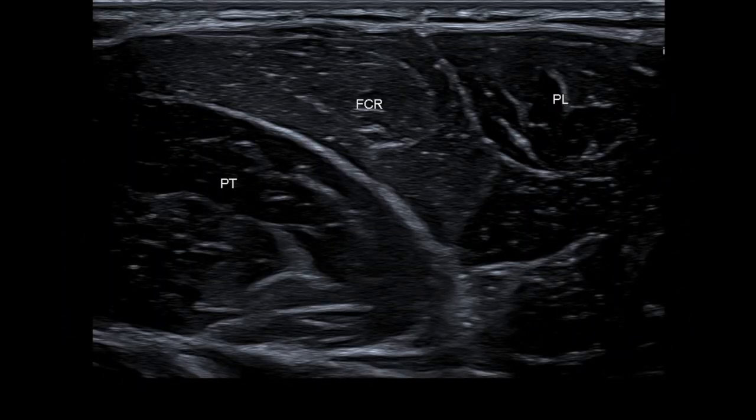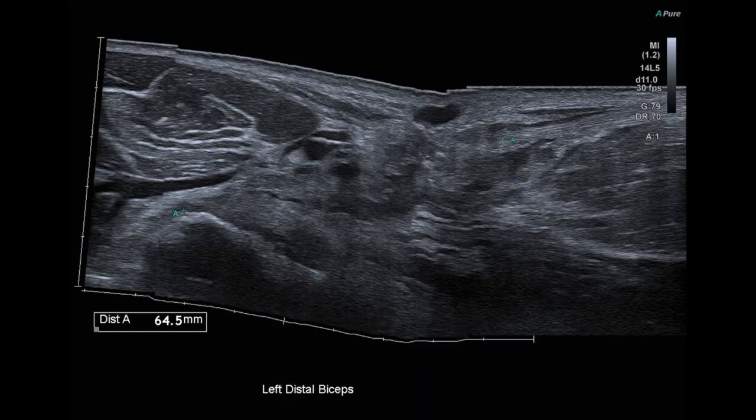Now, direct visualization is sometimes difficult, so the cheap way to do it is to scan the volar aspect of the forearm and look for any cobblestone pebble edema superficial to those flexors. If we see that, that suggests that the lacertus fibrosus is torn, which generally results in a greater degree of retraction of the biceps tendon, and this may change the surgical plan.